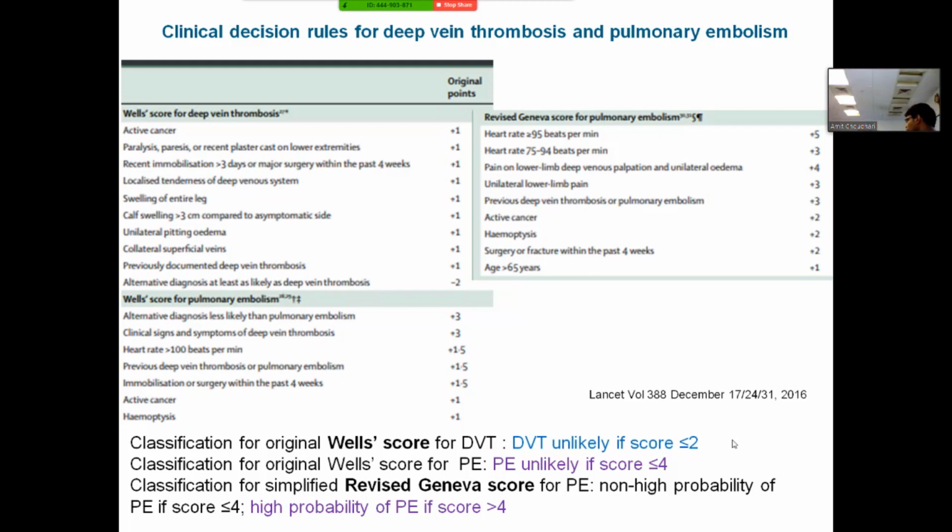Because of this, we can know the proximal extent. If it is not having that phasicity, then we get to know that there is something abnormal in the proximal system. If it is monophasic, but there is no undulating line, and it is a very slow flow, then there is a probability that we are having significant embolus in the proximal venous system. And if, when we are giving augmentation, it will not rise, then we are having distal embolus. So at one point of time, if you do this, you will get to know whether there is anything proximal or distal.